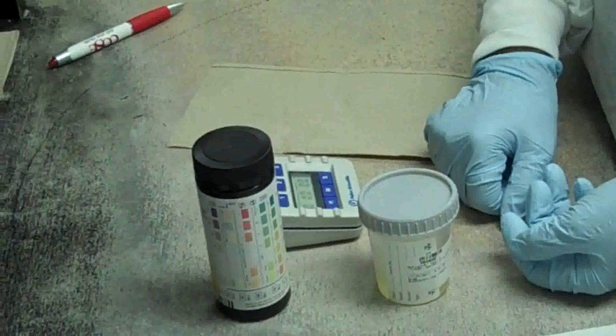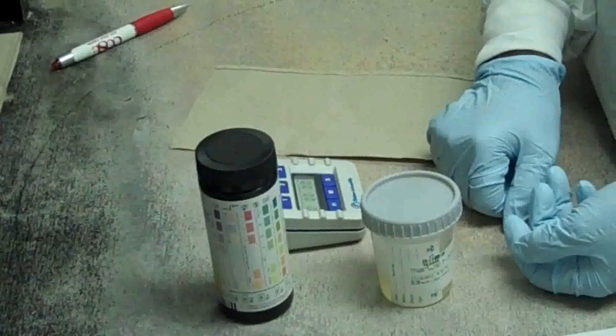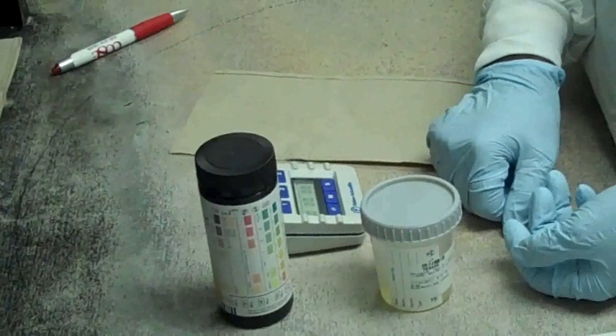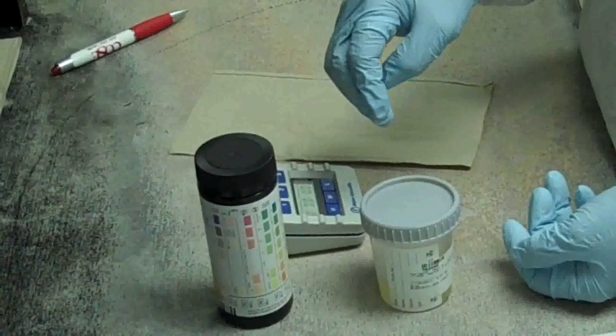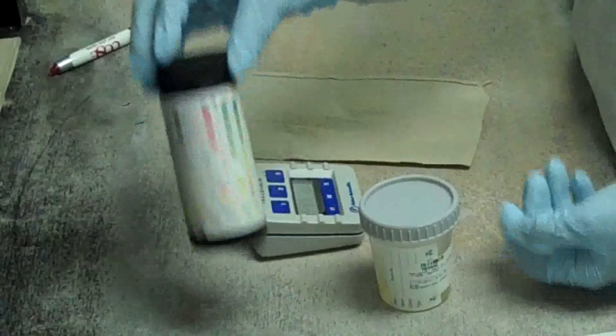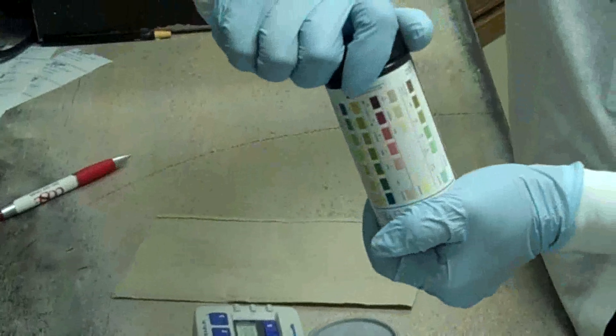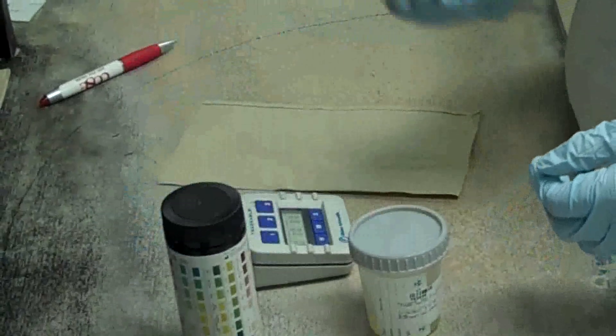Assure the open date, receive date and QC date are indicated on the reagent bottle when first opened. Do not remove the strip from the bottle until immediately before use. Replace cap immediately and tightly after removing the strip. Avoid touching the test areas of the reagent strip.